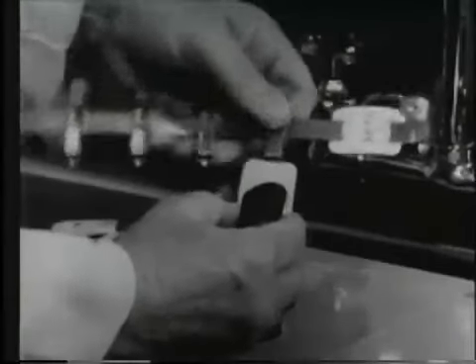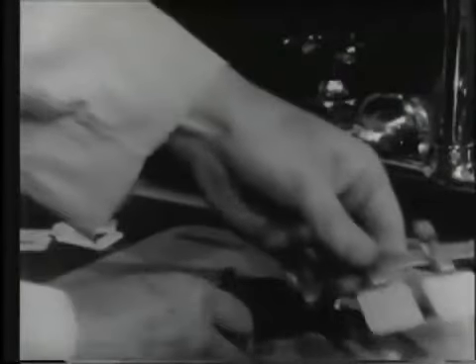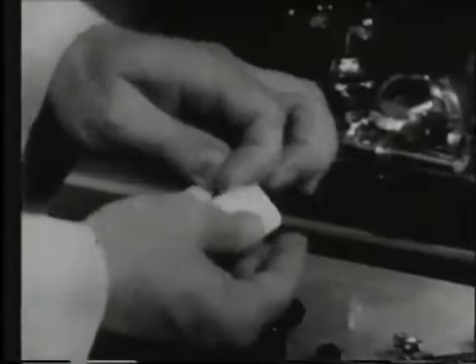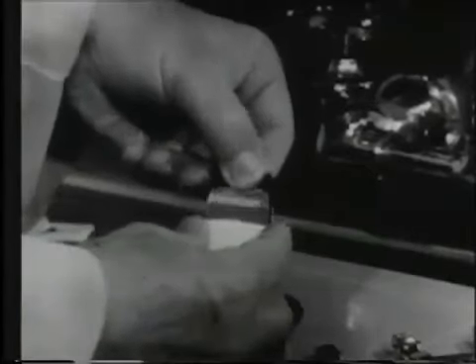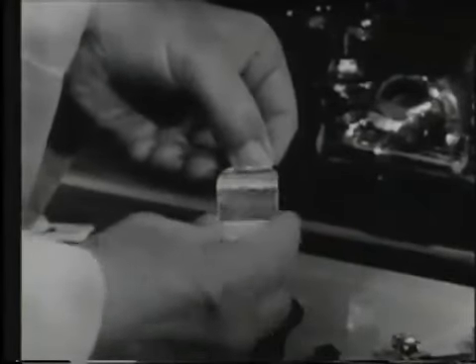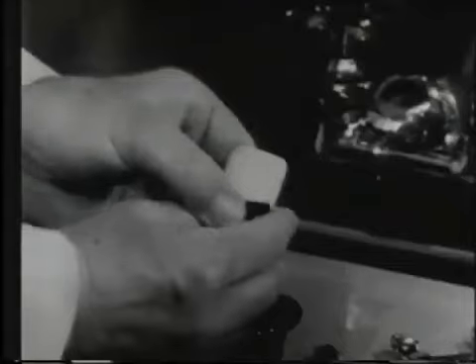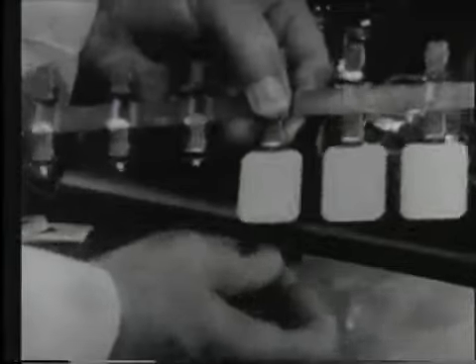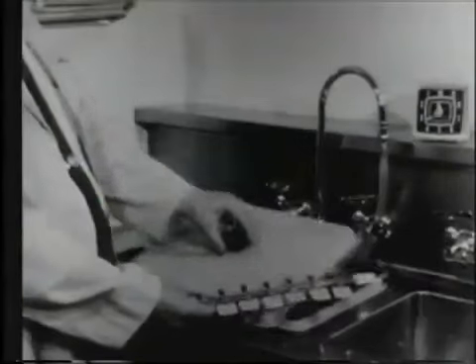So we clip the first film on its shorter edge in the center, and then the second film, and discard the wrappings. The next film packet is of a different type, and it contains only 1 sheet of film. We pull on the tab, discard the sheet of lead, and then this time we'll just fold back the black wrapper, handling the film through the wrapper and not touching the film at all. So we've indicated 2 ways in which we can fasten the film to the rack without actually touching the surface of the film. We gather up the scraps and put them down the hole leading to the wastebasket.